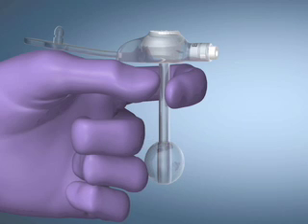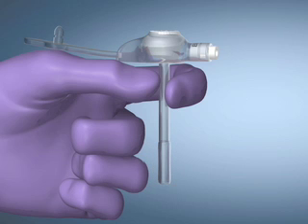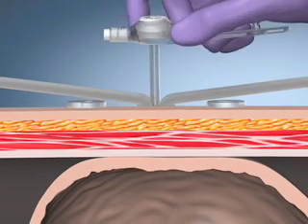Visually inspect the balloon to verify symmetry. Symmetry may be achieved by gently rolling the balloon between the fingers. Reinsert the syringe and remove all the water from the balloon. Lubricate the tip of the tube with a water-soluble lubricant. Advance the tube down the peel-away sheath and into the stomach.